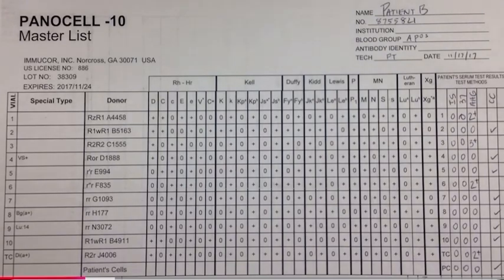So why do we have differing strengths? There are a couple reasons why we can find ourselves in this situation. One is because of the effect of dosage, that if we have a homozygous antigen expression, it's going to be stronger. Maybe it's going to show a 3+, and if we have heterozygous, it will be weaker, and it's a 2+. Or we may be looking at a situation where there's more than one antibody present.